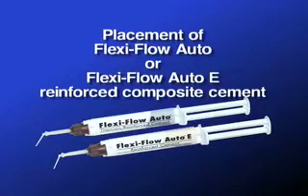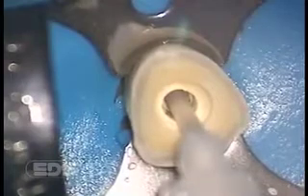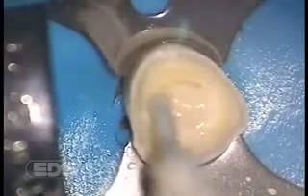We now place FlexiFlow Auto-E in the canal to cement the post. FlexiFlow Auto-E is a self-curing, reinforced hybrid composite cement. It has a proven and researched 10-year fluoride release, therefore minimizing secondary decay.